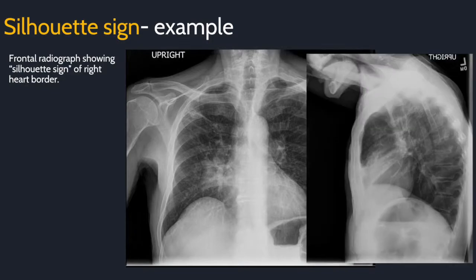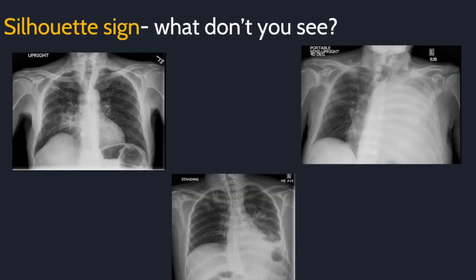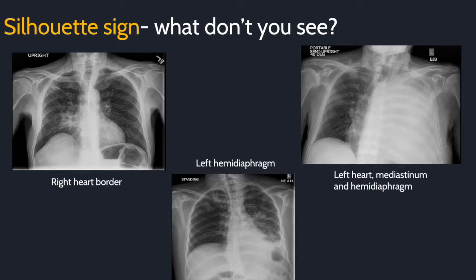The lateral radiograph confirms this with a wedge-shaped opacity. The patient also got a CT, which shows the pneumonia in another modality. Here are some examples. Remember, the name of the game is: what don't you see? The right heart border, left hemidiaphragm, left heart mediastinum, and left hemidiaphragm.